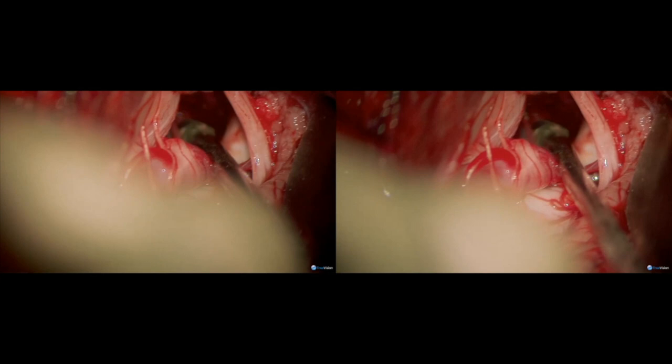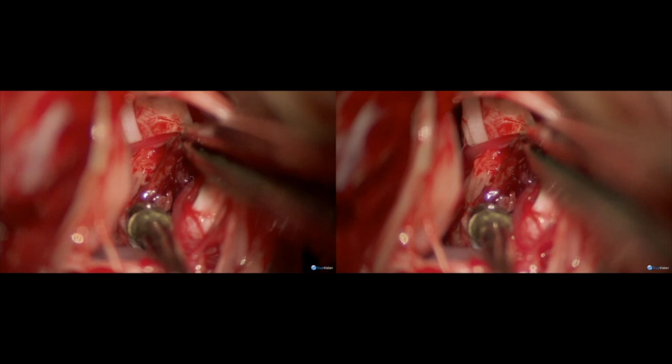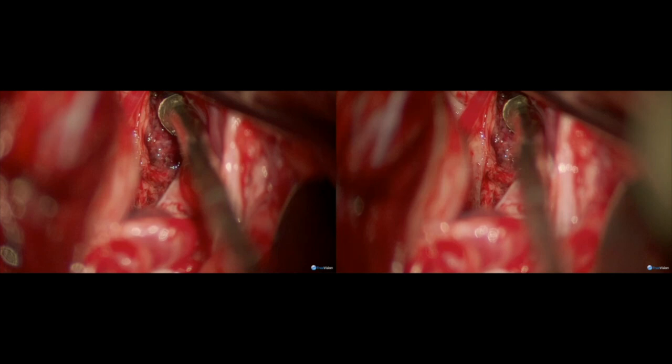A micro-nerve hook can be very helpful in bringing into view small residual pieces on the side walls of the resection cavity. Again, bipolar cautery should only be used in a very targeted fashion for focal bleeding points. Some final residual pieces are removed from the medial wall of the resection cavity, taking care to avoid injury to the developmental venous anomaly. A careful final inspection of the resection cavity reveals no evidence of residual cavernoma. The surrounding hemosiderin ring is not chased in such an eloquent location.